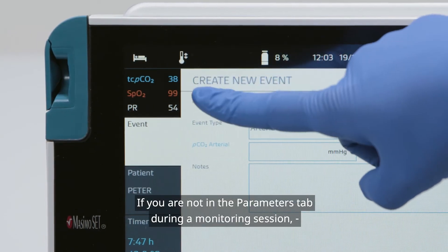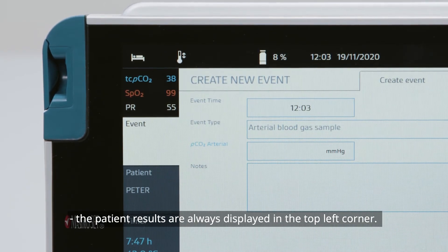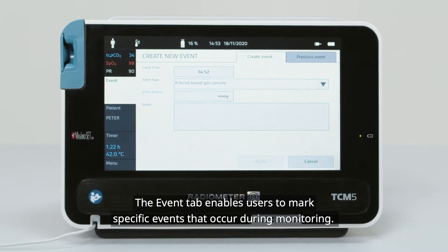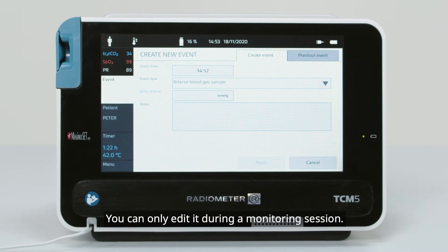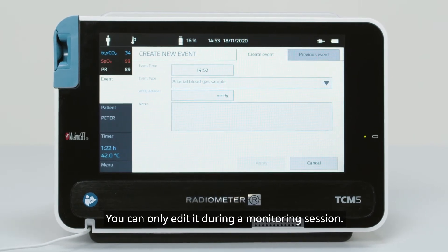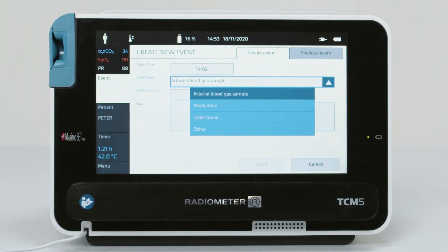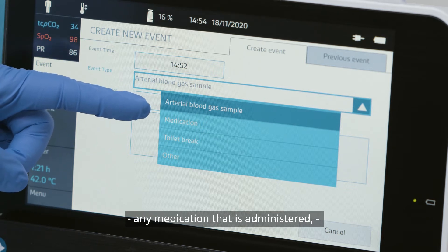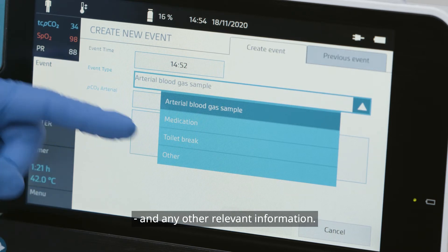If you are not in the Parameters tab during a monitoring, the patient results are always displayed in the top left corner. The Event tab enables users to mark specific events that occur during monitoring. You can only edit it during a monitoring session. These events can be selected from the drop-down menu, including arterial blood gas values, any medication that is administered, if the sensor is removed because the patient has gone to the bathroom, and any other relevant information.